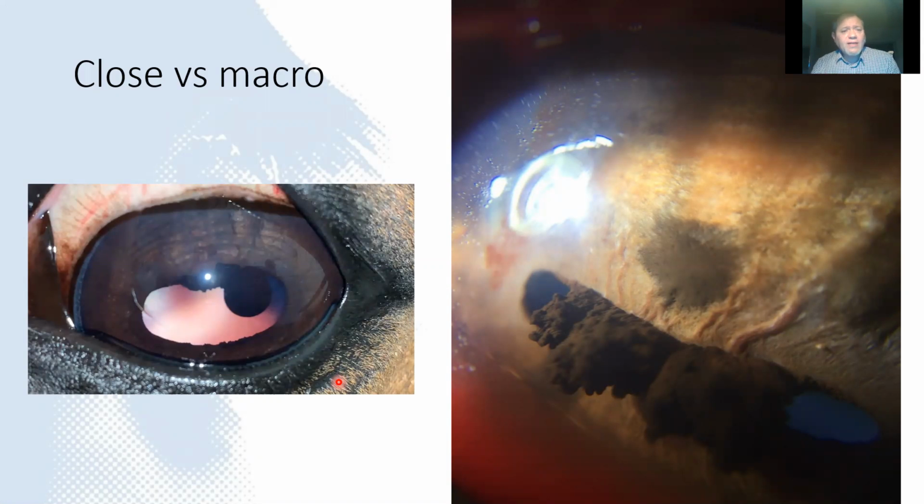Here we have this image to highlight the iris cyst, and we added in coaxial lights. It's effectively distant direct, but we've zoomed in, so close distant direct, which allows us to comment on the likely effect of the iris cyst on the visual field in this eye. And using macro lenses we can actually look at the surface itself, to look at another iris melanoma.